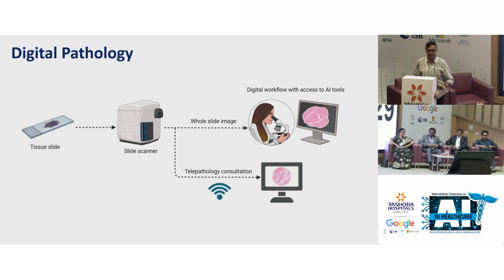One thing we were discussing is that you can do a remote diagnosis sitting at your home, or you can send the pathology slide across to multiple pathologists who could give inferences on those slides. So once you digitalize these whole slide images, you will see a wealth of opportunities that can come with it. But the challenge is, are we ready in the Indian setting?